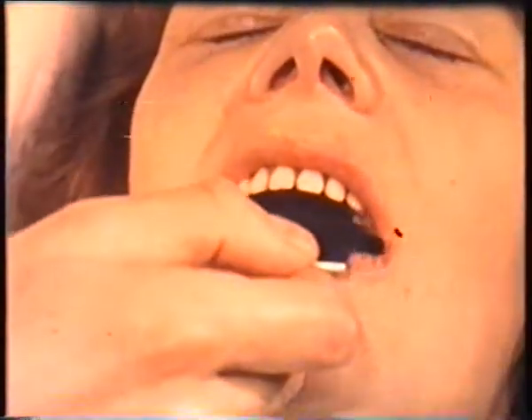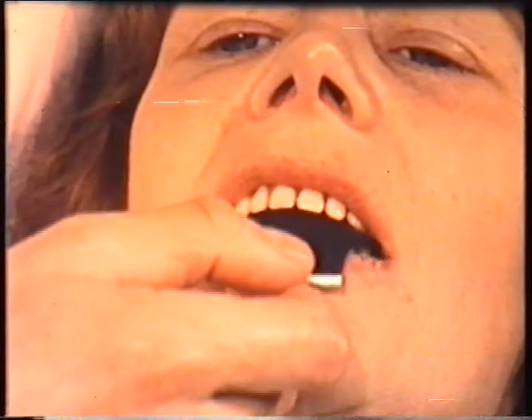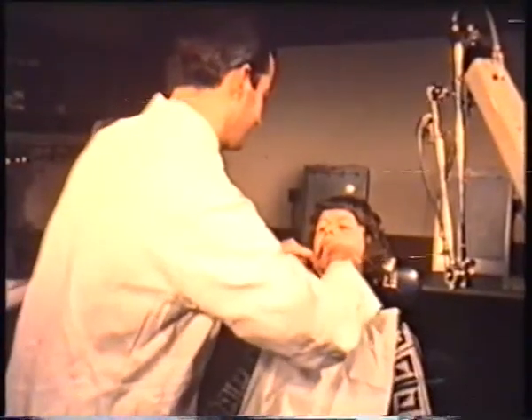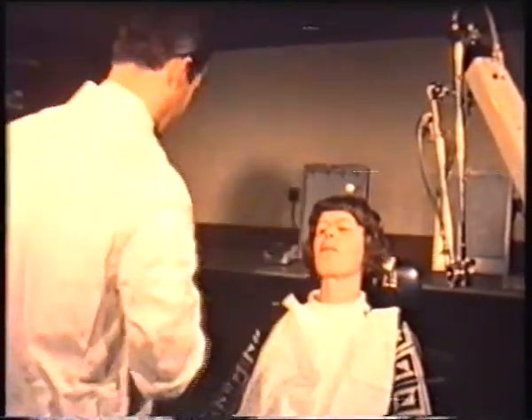The occlusion should be checked with blue paper, and any obvious premature or heavy contacts reduced by selective grinding. At the same time, the periphery in the right upper incisor region can also be reduced.